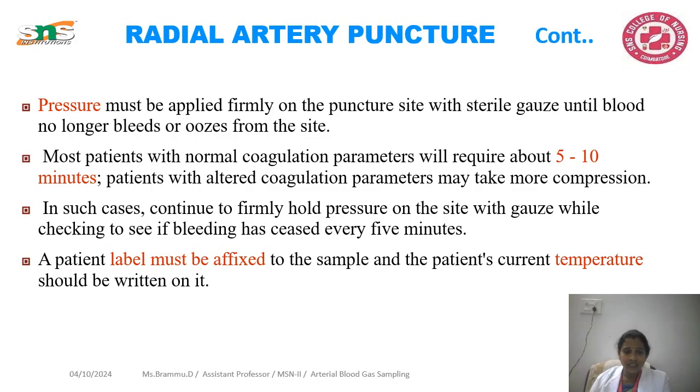And the patient's temperature must be noted, and whenever you send the sample, the site you have selected, how many ml have been taken, and the temperature of the patient must be reported to the laboratory.